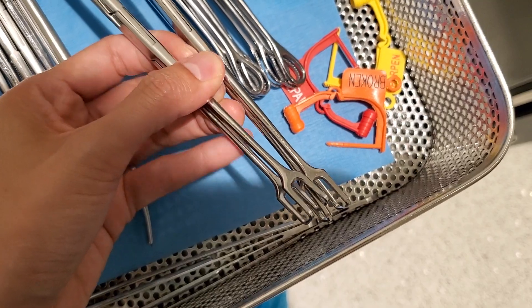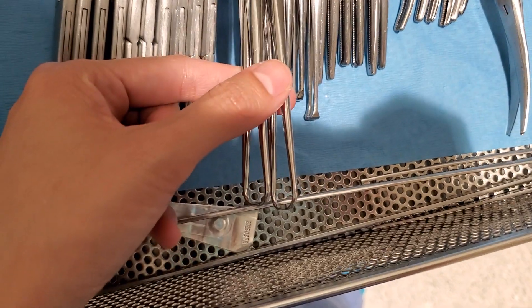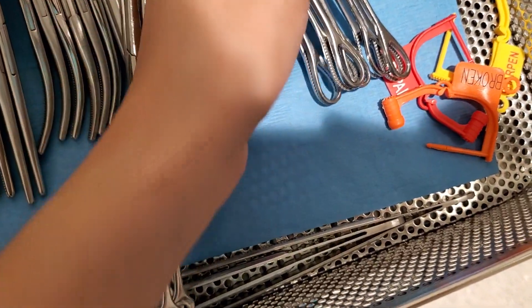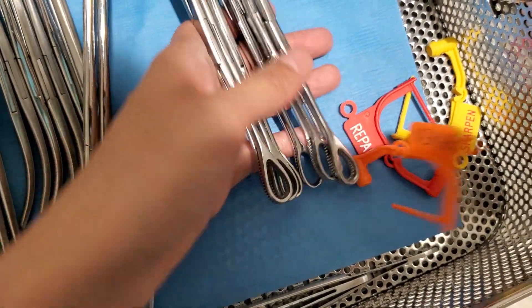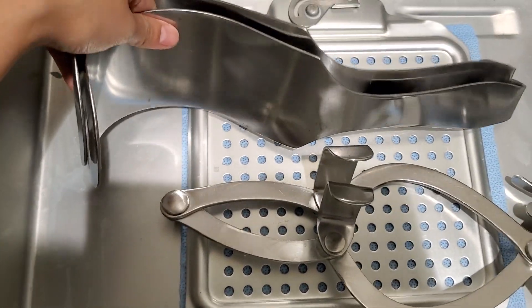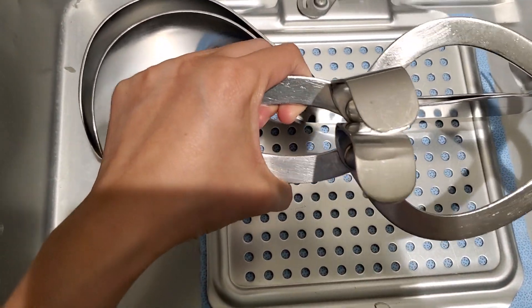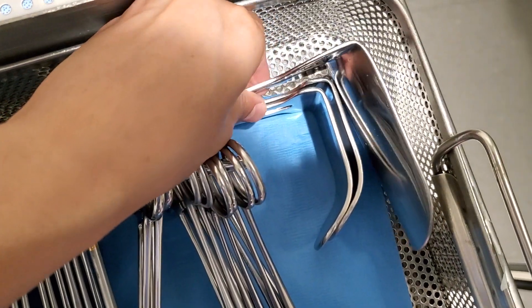We call them double tooth sharp tenaculums. They're the same as the single tenaculum but this one is single and this is double. These are your sponge forceps. These are large Deavers and this is an O'Sullivan O'Connor retractor and it comes with three blades.